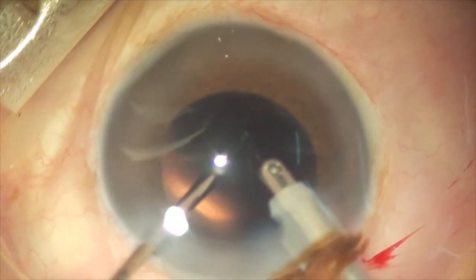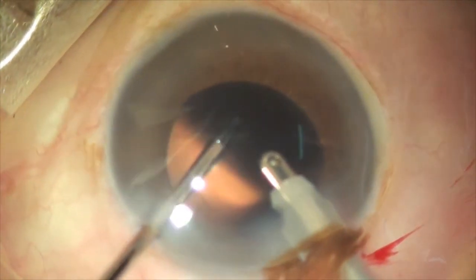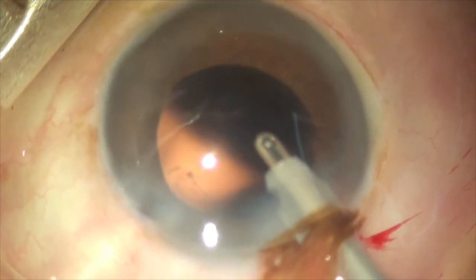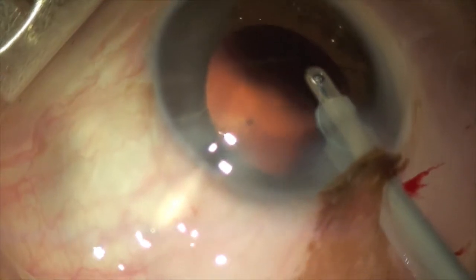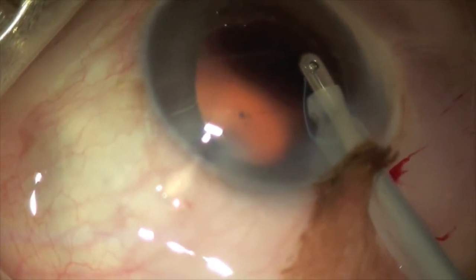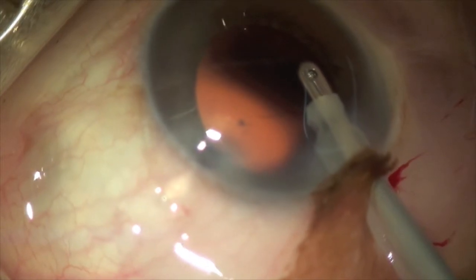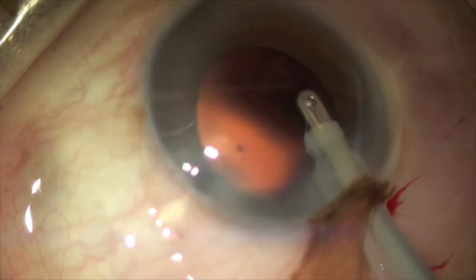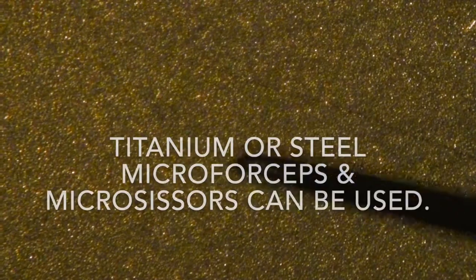And I complete the CCC successfully. I am moving the eye down so that we can see the curvilinear capsulorhexis on the posterior capsule in this particular view. A toric lens was successfully implanted in this particular patient.